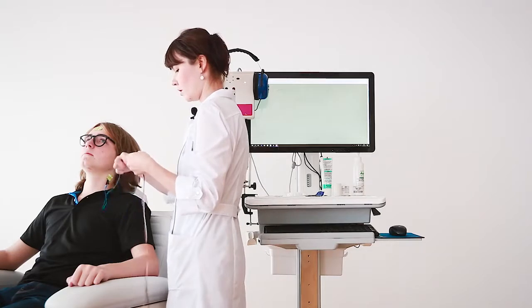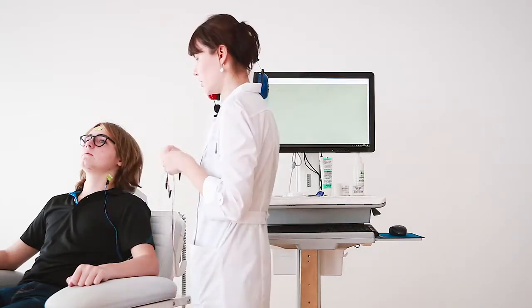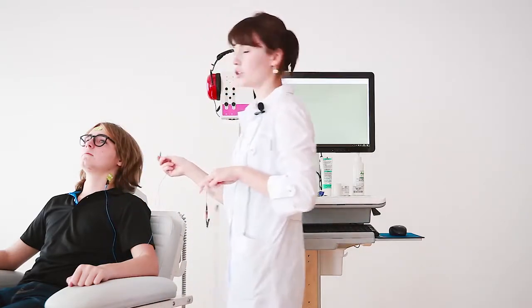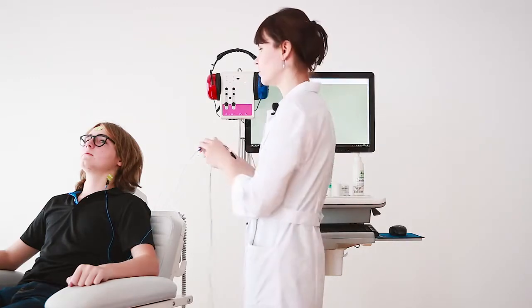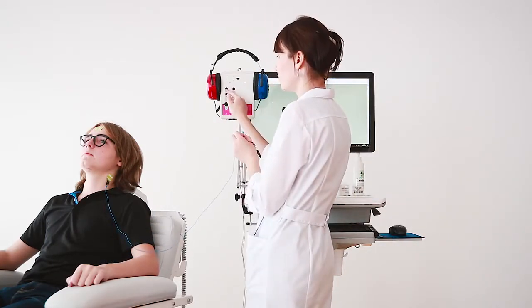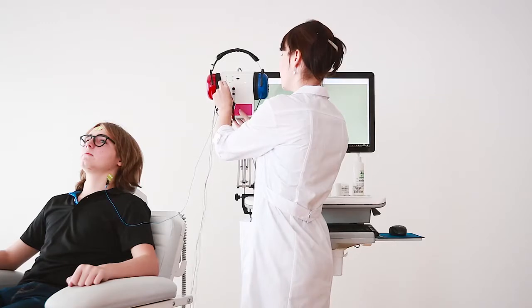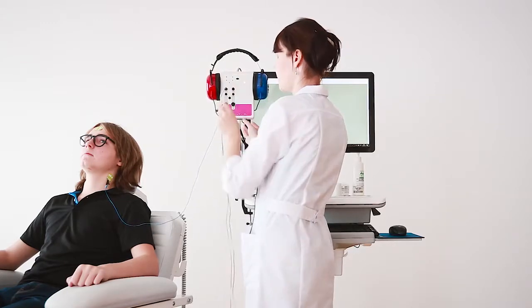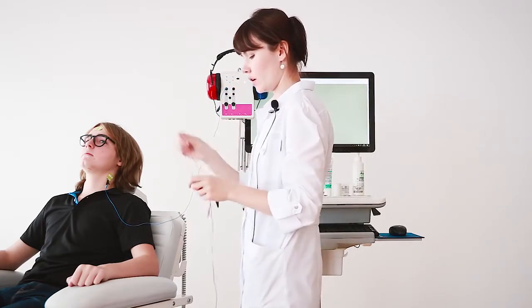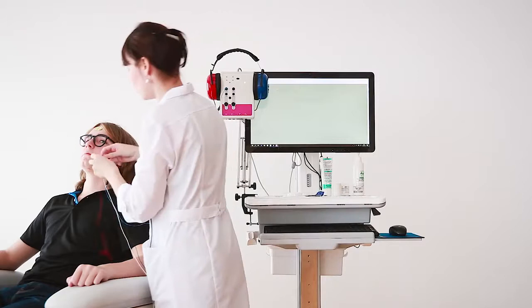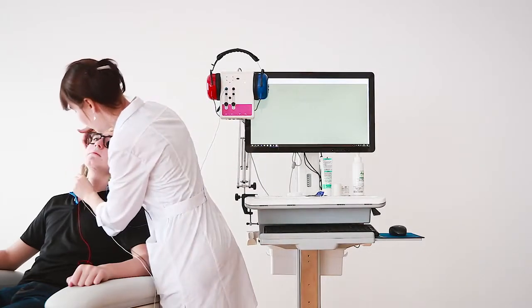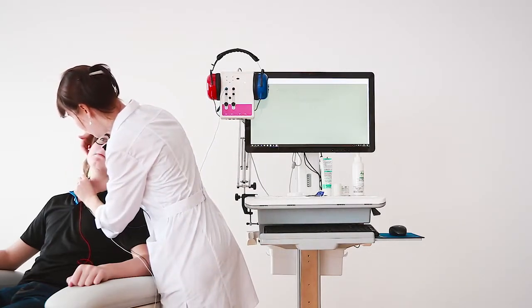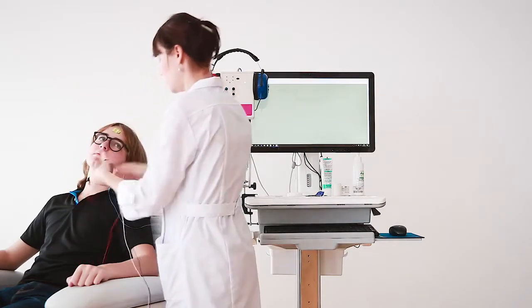The active electrode which is situated on the left sternocleidomastoid muscle we connect to the first minus channel of our amplifier. The active electrode which is situated on the right sternocleidomastoid muscle connects similarly.